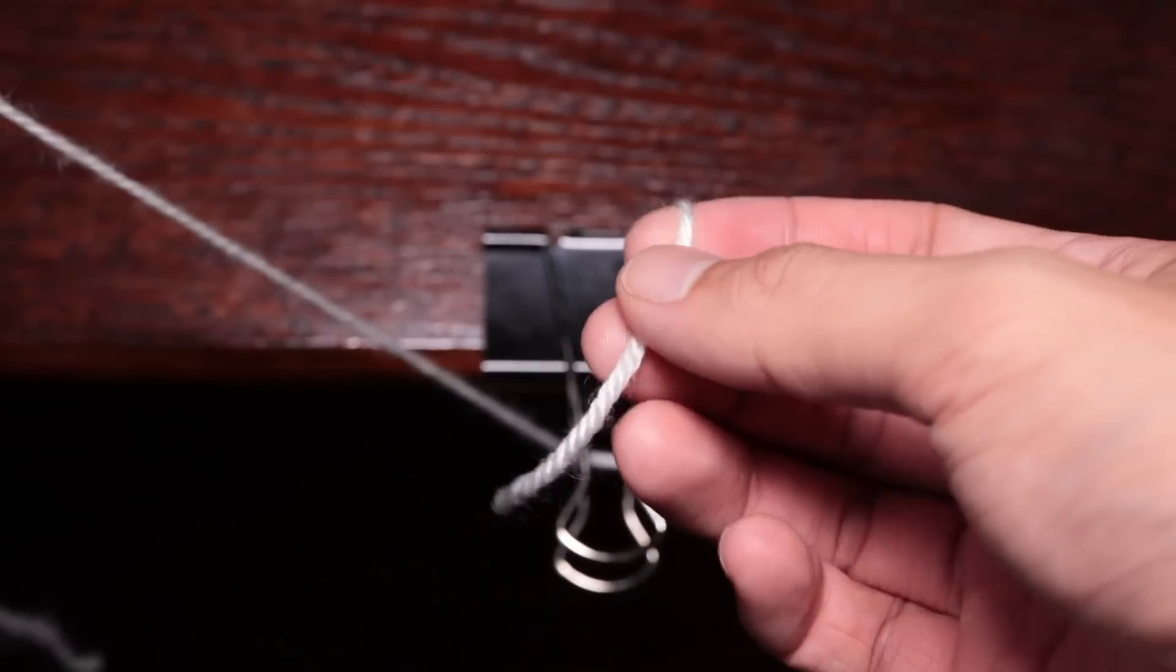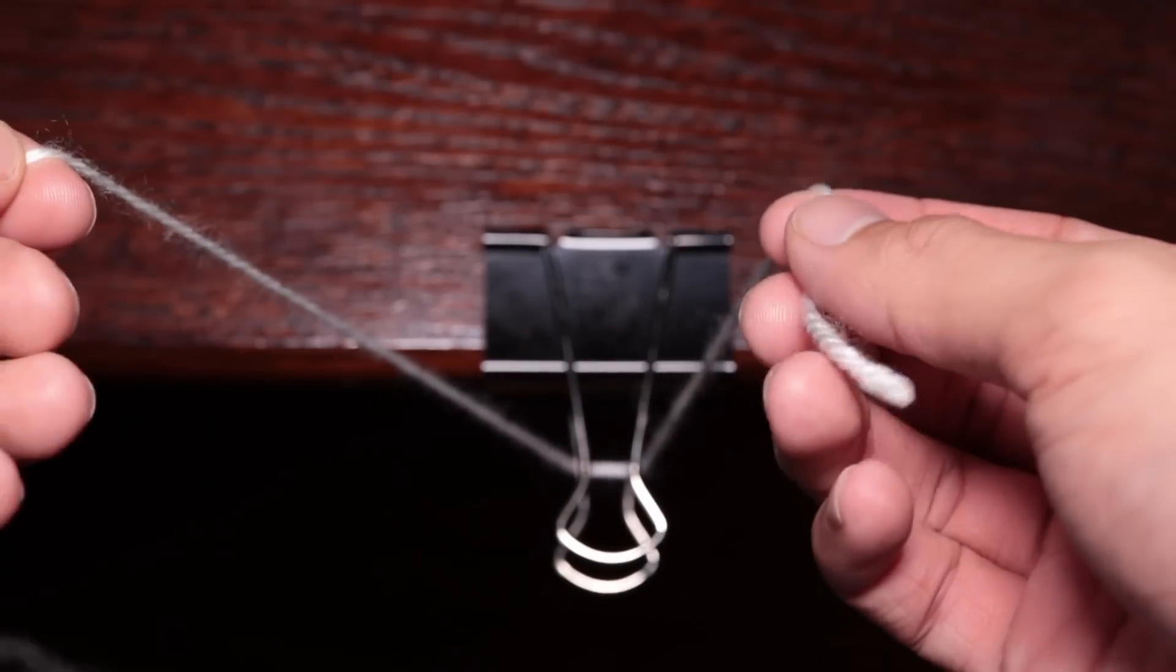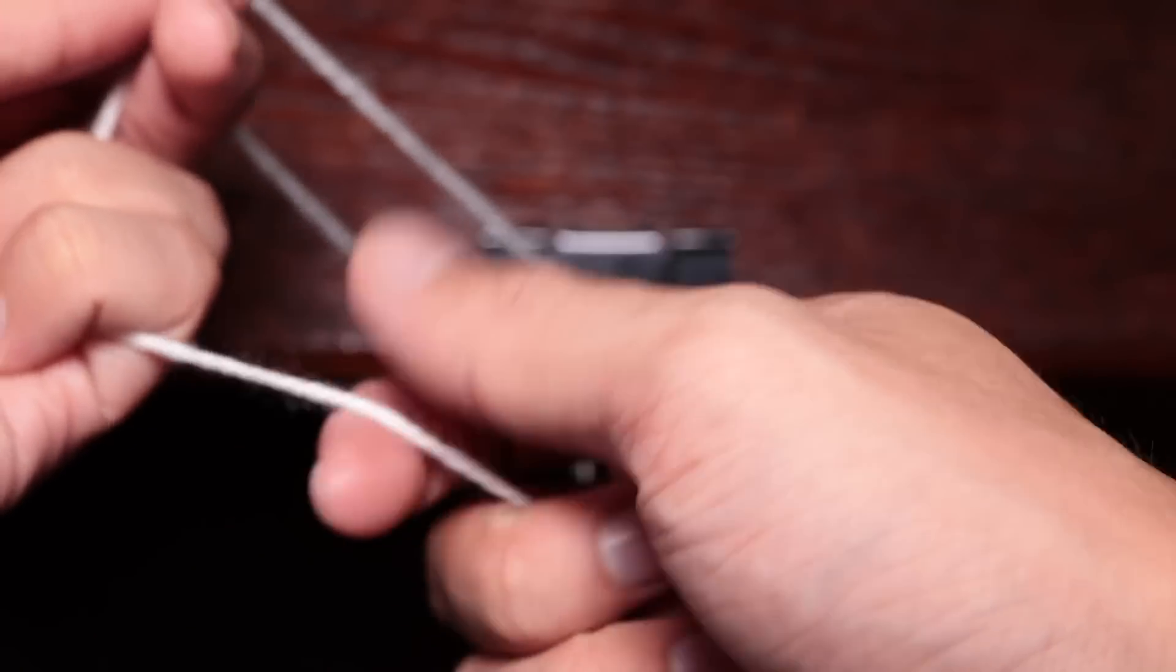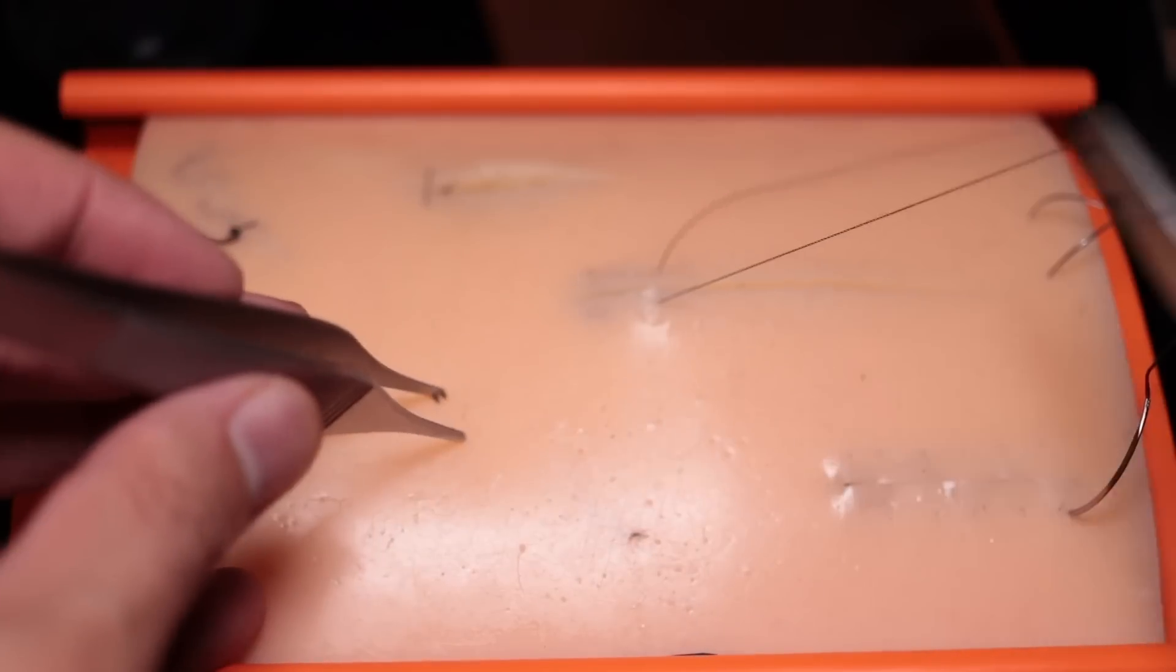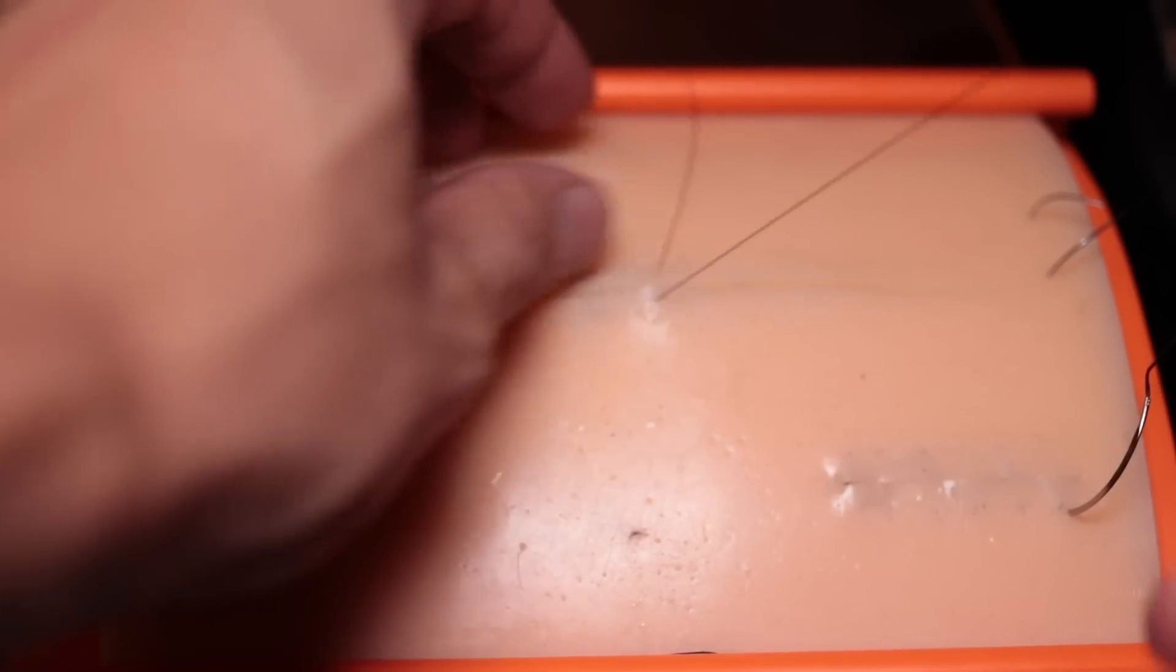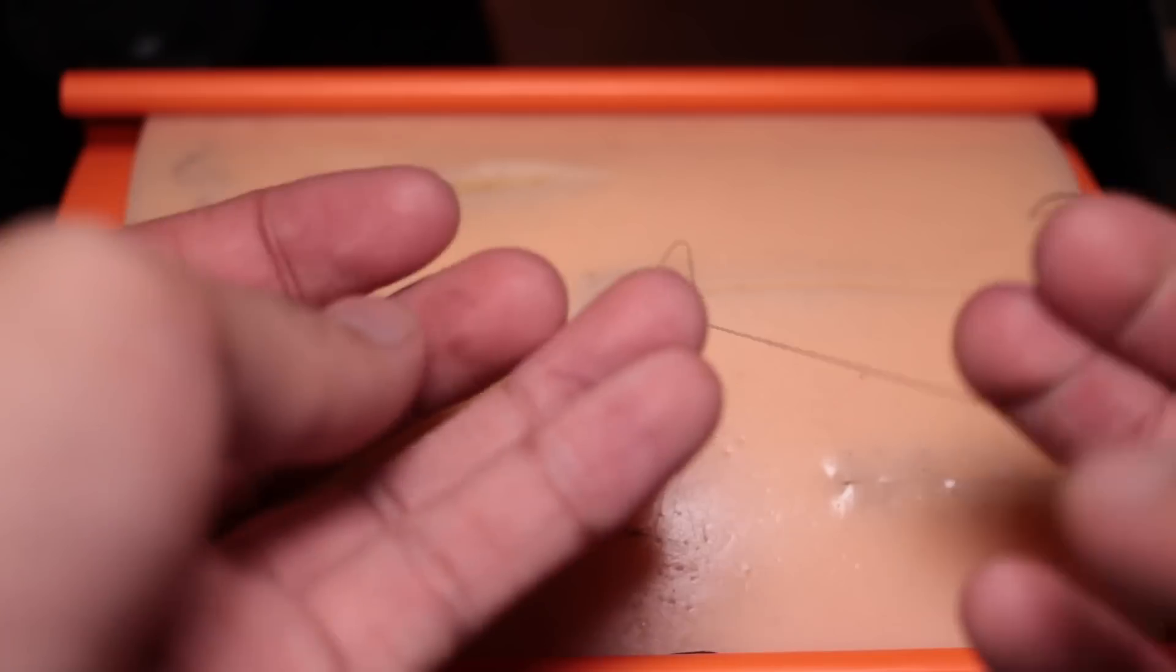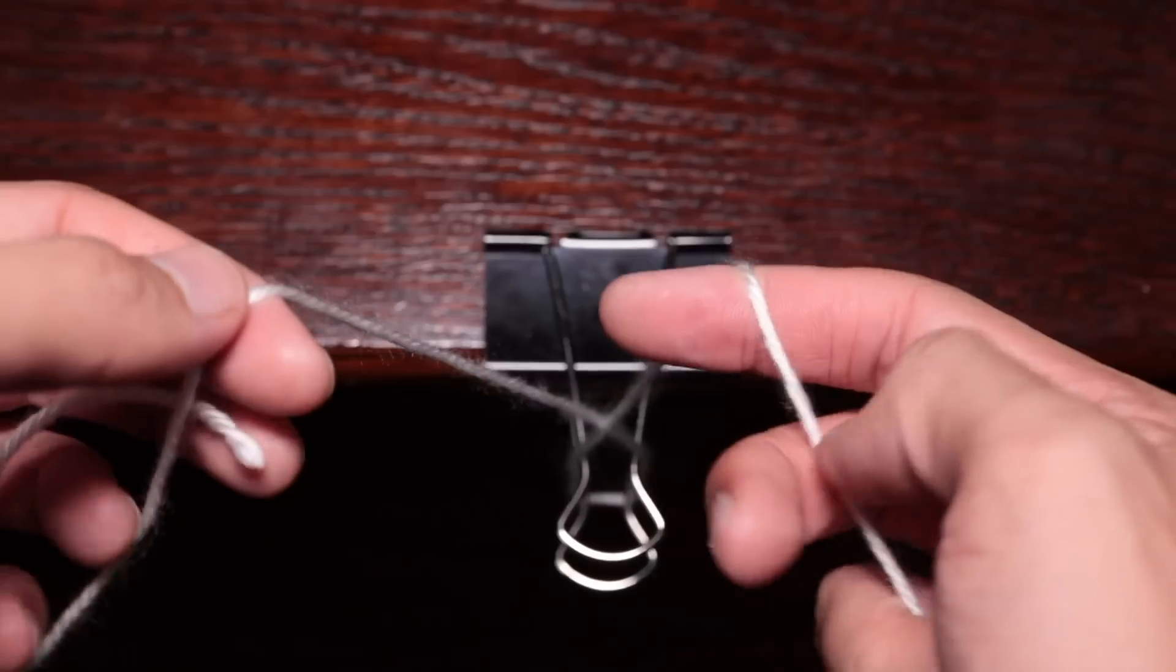So then you have the free end on the other side, which means that this hand here is going to be the one that's simulating holding the needle grasper just like this. It's important to keep that in mind because in real life there's always going to be one free end and one needle end and you don't want to treat them both equally.